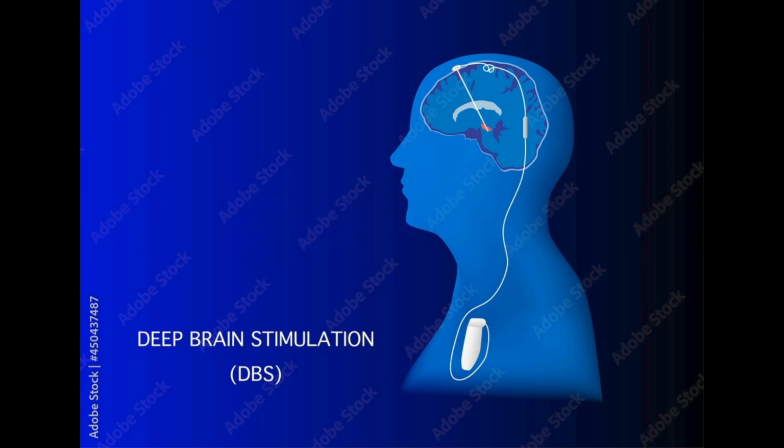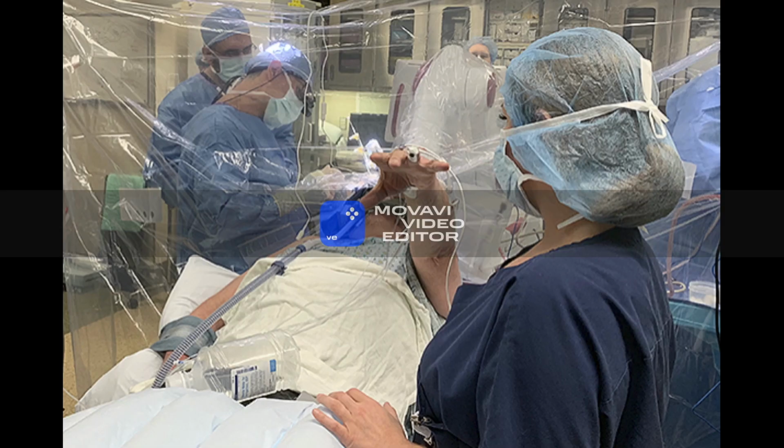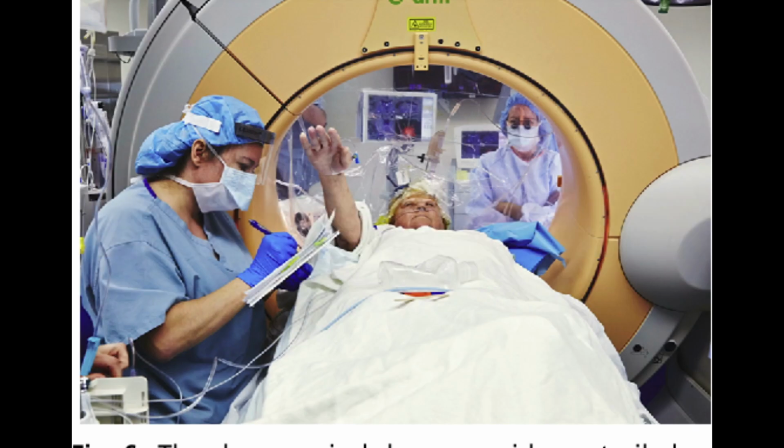For a variety of neurological disorders like seizures, deep brain stimulation is a common treatment used. After a neurologist determines exactly where the electrode arrays need to be placed, a procedure is performed. It is important for the patient's health and recovery that these arrays are placed in the precise location they were intended for. This verification can be done during or after surgery with a variety of imaging modalities, but most commonly computed tomography or CT. However, these machines can be bulky and expose patients to ionizing radiation, which must be avoided.